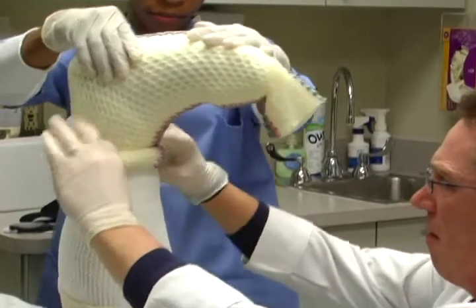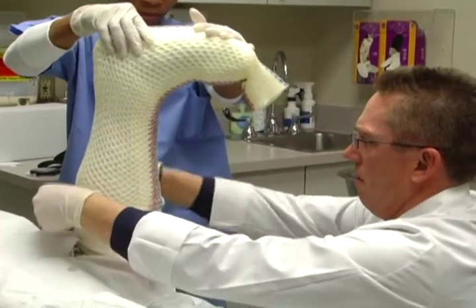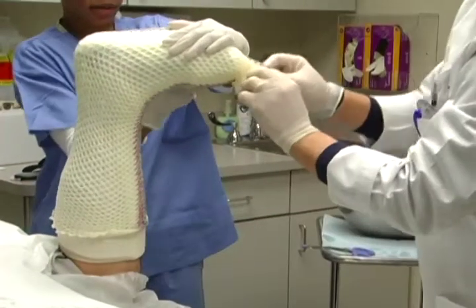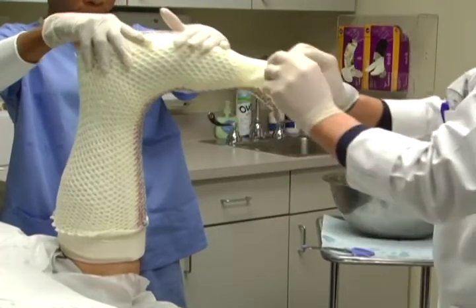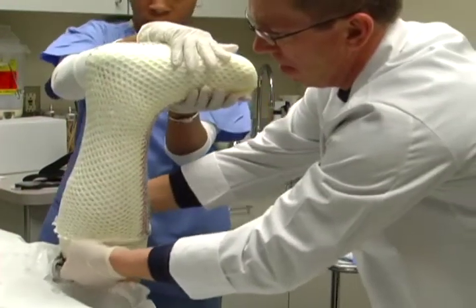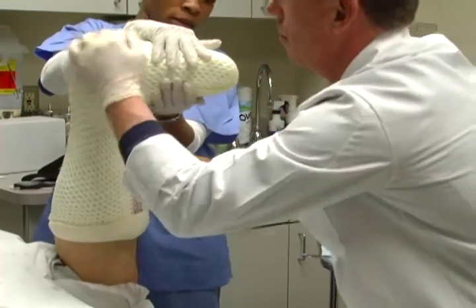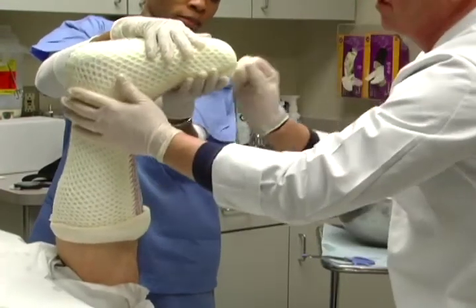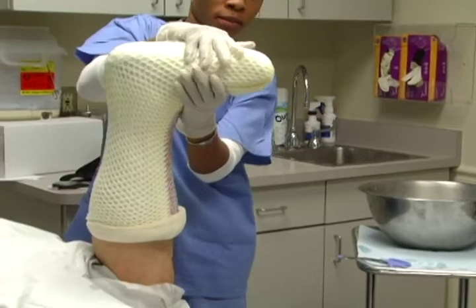Gently unroll the sock towards the knee, using your thumbs to push and stop at the widest point of the calf. If necessary, slide your fingers between the patient's dorsal arch and the sock to smooth out any wrinkles. It is very important to remove all wrinkles as they can cause irritations. Fold back the excess cast sock over the dorsum of the patient's foot and hold in place. To complete a finished edge, roll the proximal edge of the stockinette distally, covering all loose edges. Then, fold back any excess cast sock to the widest point of the calf to shorten the cast length.